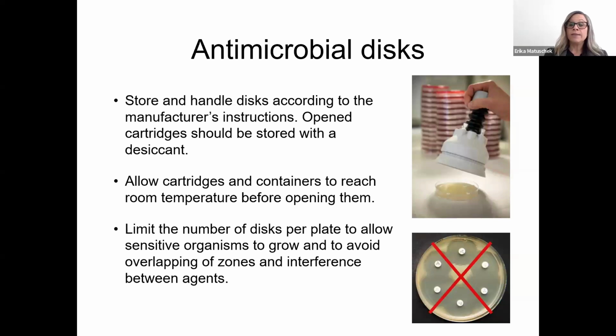When you apply the discs on your inoculated agar plate, it is important to limit the number of discs per plate. There are a couple of reasons for that. One is that if you have a very sensitive organism that will have large zones for many antibiotics, there will not be enough space on the agar surface, or you might not even see that you have a bacteria growing there. But it's also important to avoid interference between agents that we do not want to have on our test.